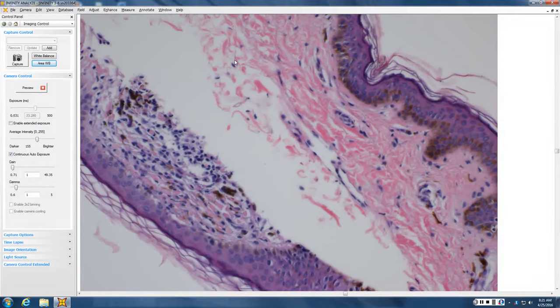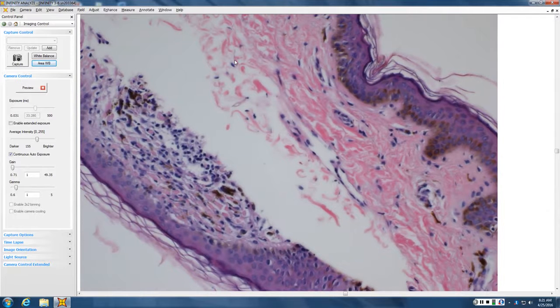Looks like we kind of have a thin epidermis, and just deep to that is a cluster of pigment-producing cells. So, do you think it's likely that this is pigment-producing or pigment that dropped out of the junction? Yeah.